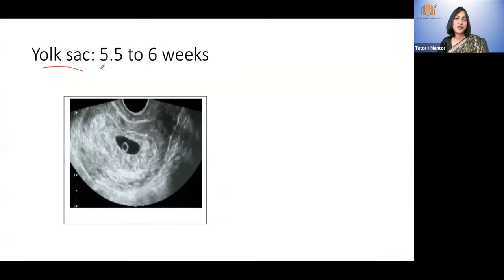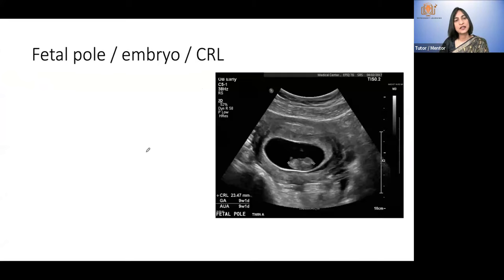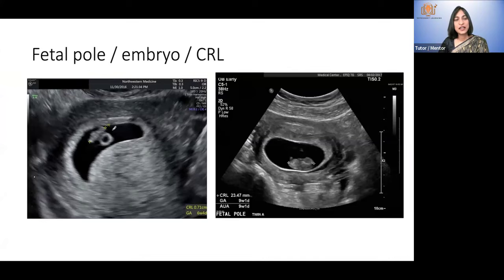Now, the yolk sac. See this beautiful picture — that is the endometrium with a nice intense choriodecidual reaction around it. There is a proper white circle with black fluid inside — this is the yolk sac, which you see before six weeks. Then you see the embryo.